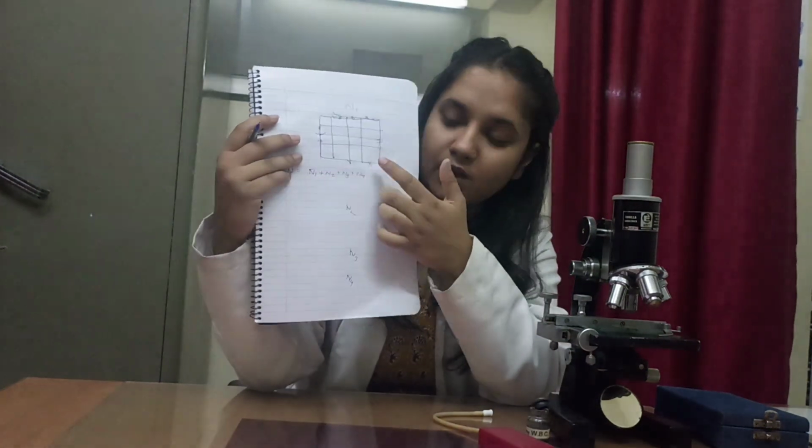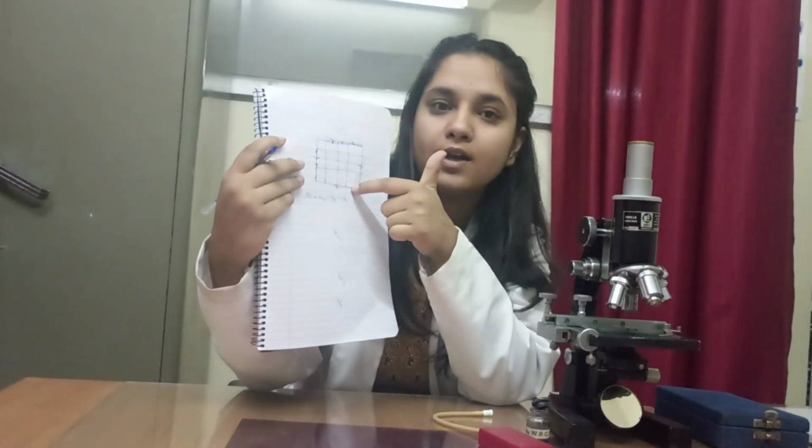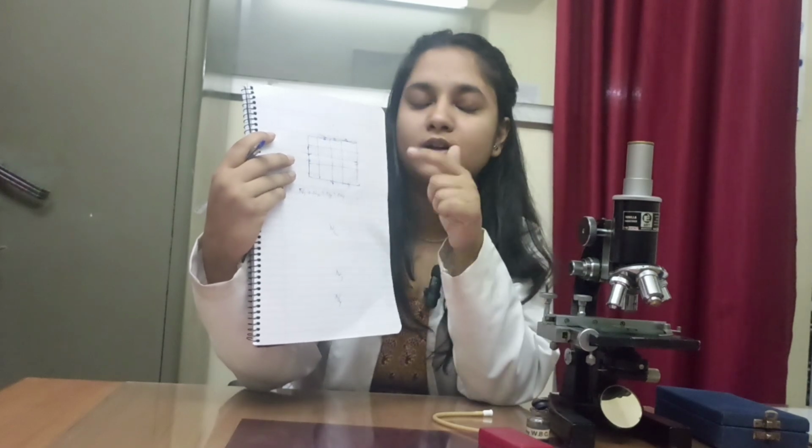Same thing is required in the first, second, third and fourth. The upper border and the left border of the square should be counted, but the lower border and the right border are not counted in a WBC chamber.